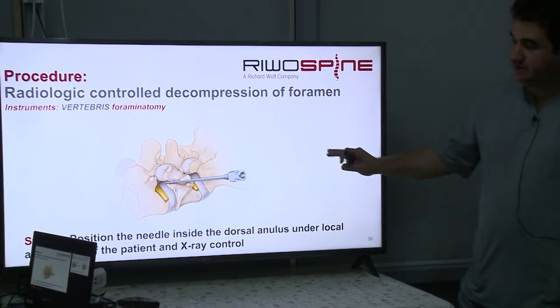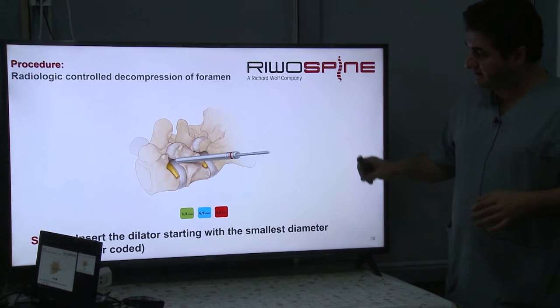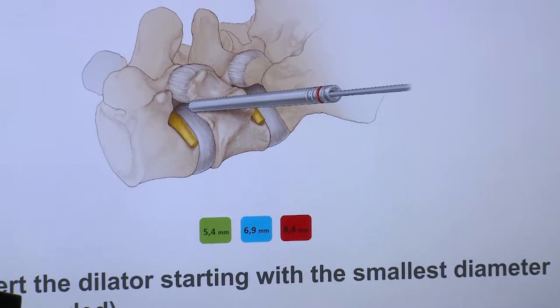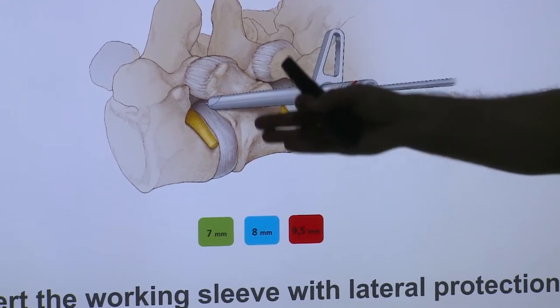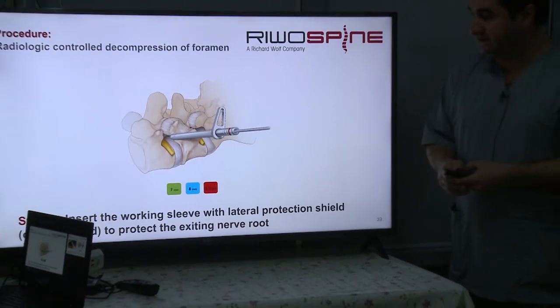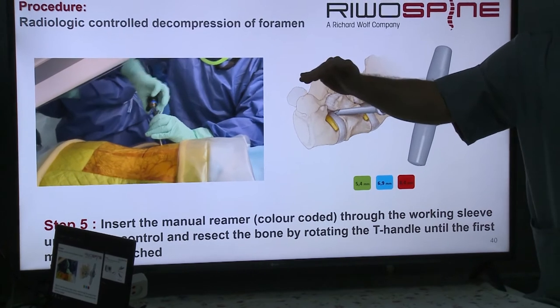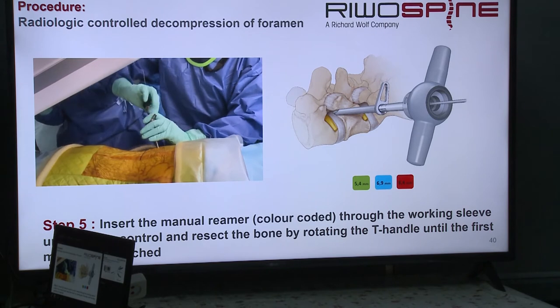And how do we do it? We do it under fluoroscopy. We place the needle, guide wire, and step dilators. The first smaller one, middle one, and the biggest one. We put the dilator there. And then again over the smallest diameter, smallest sleeve. Then you change it, you dilate it, and finally you drill it under the fluoroscopy. Then you create a space in the foramen to get access into the spinal canal.